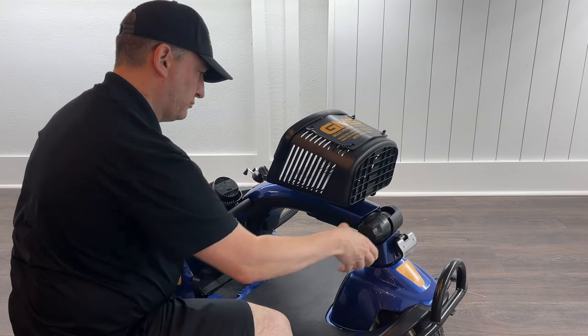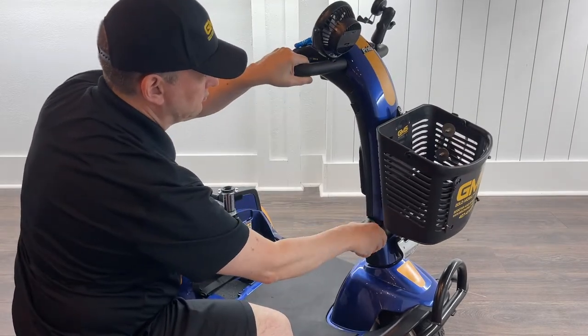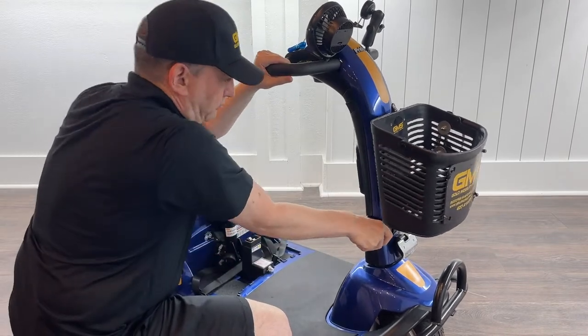Step two: to raise the handlebar, remember — lefty-loosey, righty-tighty — then re-tighten into position.